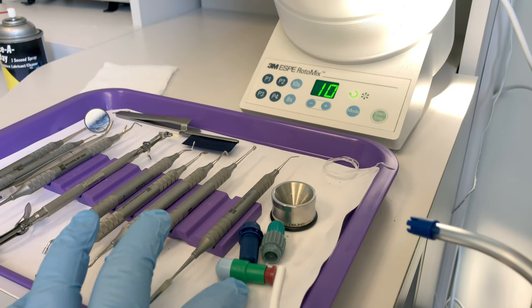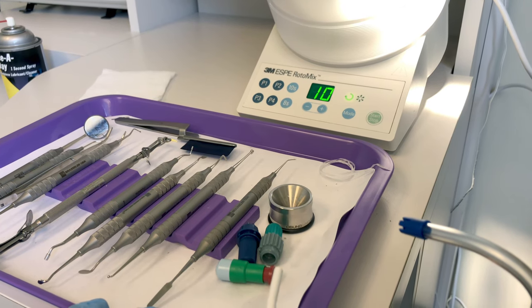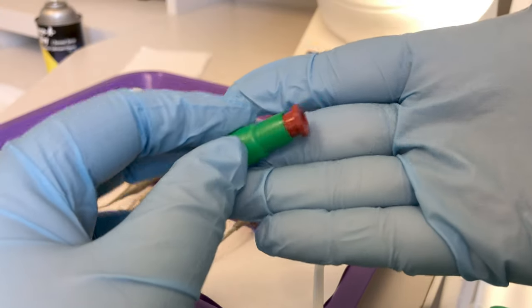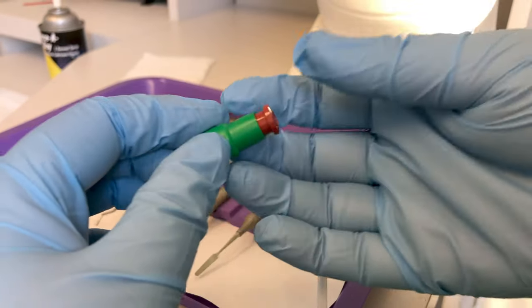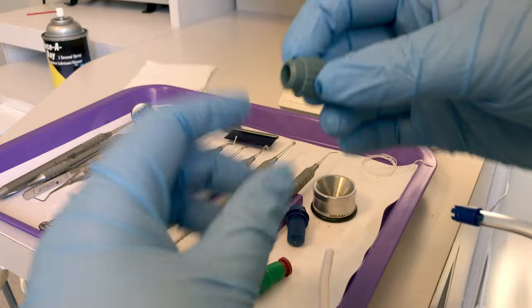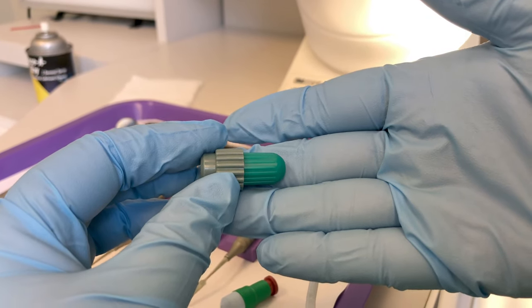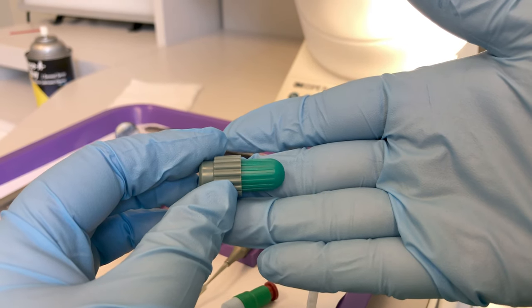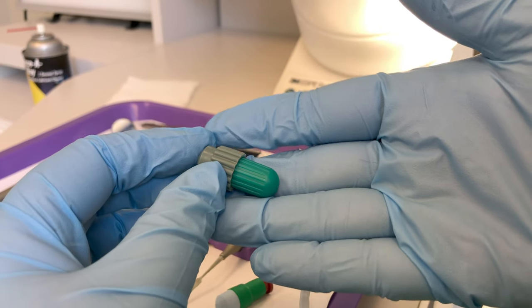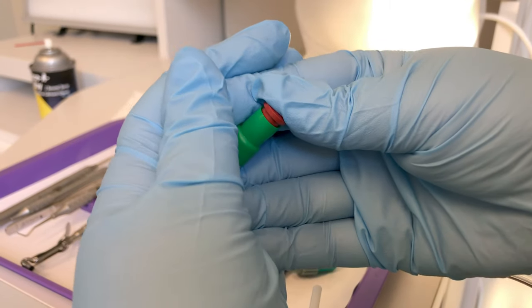We have our amalgam capsules here, and given the doctor's signal we are ready to mix. We have a capsule that needs to be activated — you push this plunger in until it's pressed in all the way. We also have self-activating capsules that when placed in the triturator or amalgamator, they mix automatically without us having to squeeze or activate the capsule.